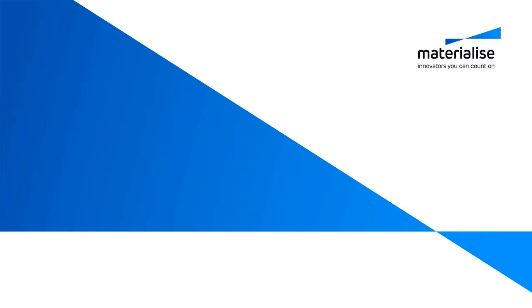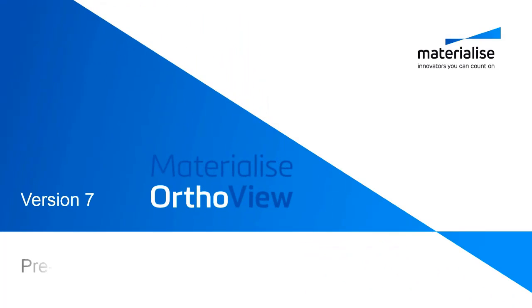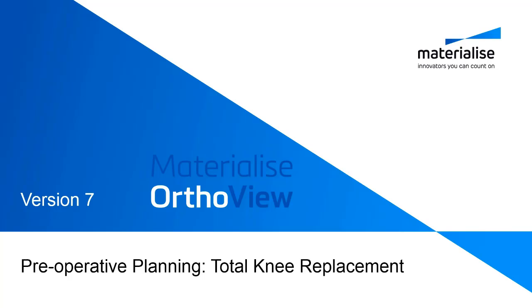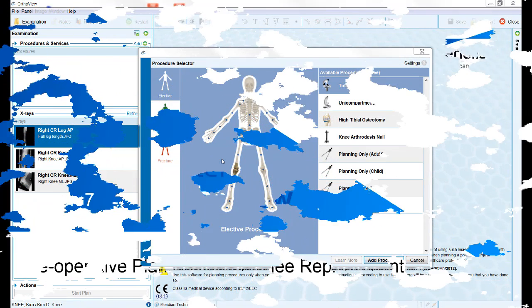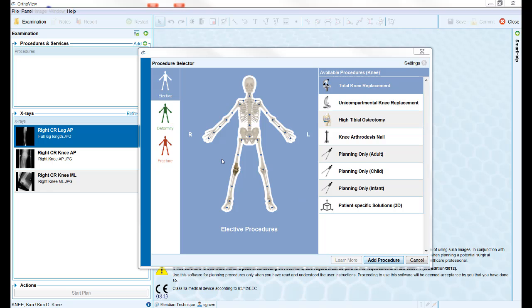This short training video will take you through the steps of planning a total knee replacement in Materialise OrthoView. Having opened the patient study, the first step is to select the required procedure for the patient. In this case we are planning a total knee on the patient's right side.